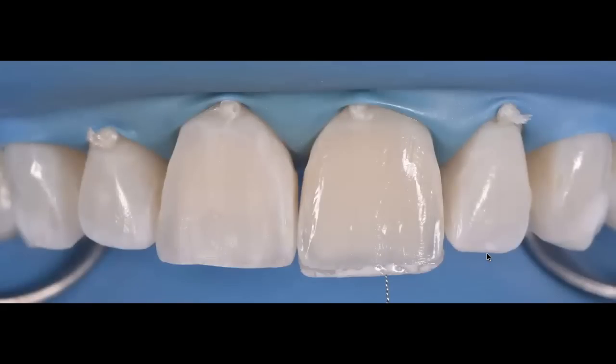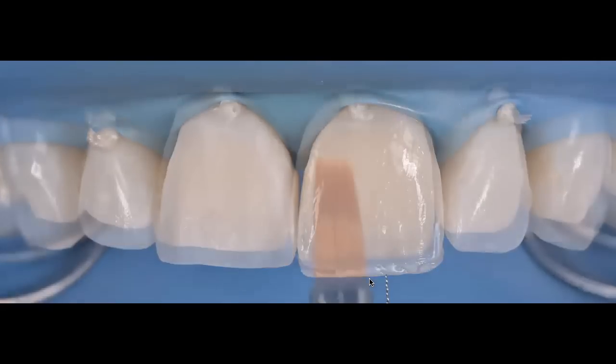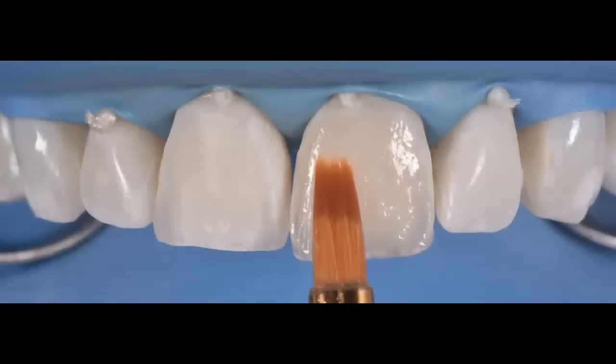This is a young female patient. And you can see here I'm using a very thin endo file, just to go about applying a little bit of that white line. I tend to apply this white line with some irregularities inside so that it appears to be natural. You do not want a straight white line because that's not the way natural teeth are designed. They really have these white opacities in a very irregular pattern. So you want to try to follow that just to give it more of a natural look.